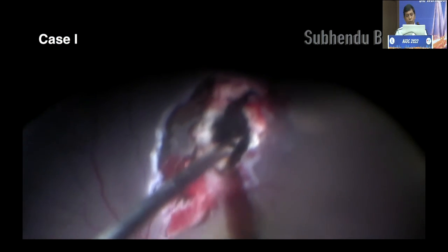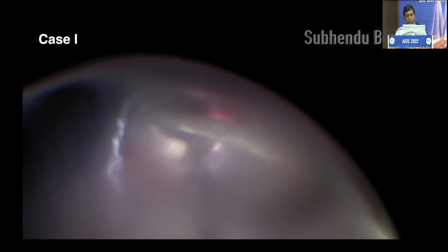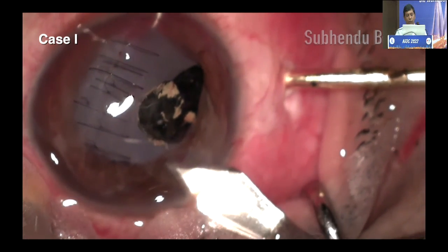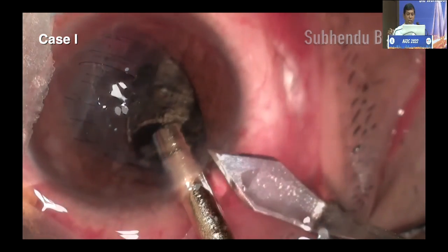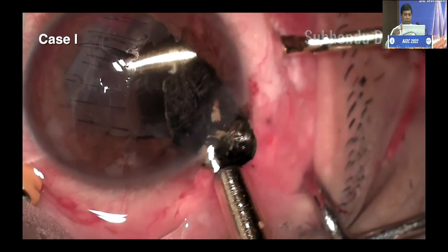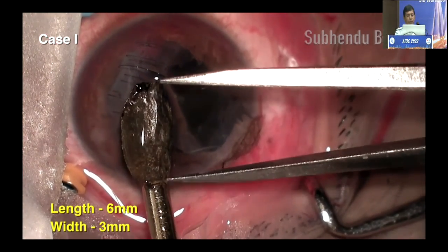Now with these deep scleral incisions, and after a little bit of struggling, he could finally get the foreign body out. And see what a huge size that is. Now another challenge is to take that foreign body out of the eye. So he enlarges an incision. See, he is holding the foreign body with a magnet in his right hand. Then he changes hand, keeps another magnet in his left hand, increases the incision further, and then he can nudge the foreign body out. That is about 6 millimeters long and 3 millimeters wide.